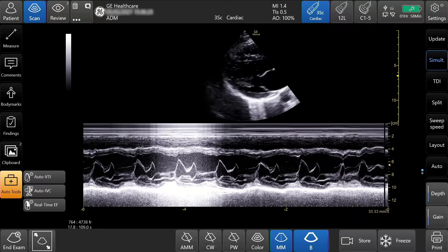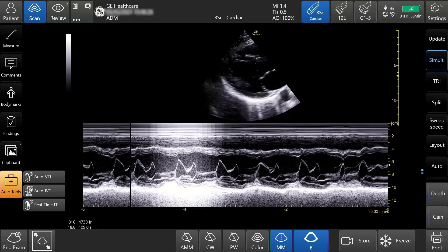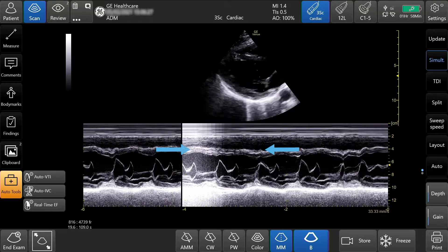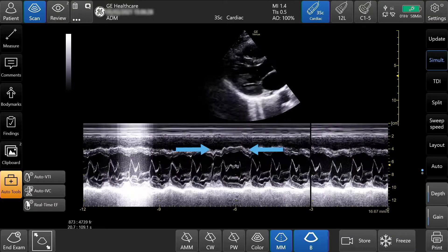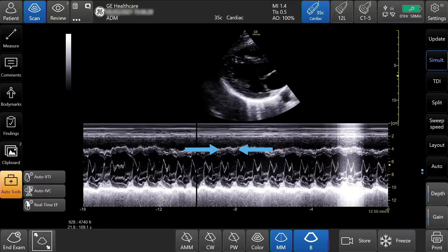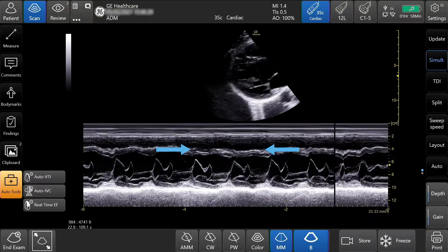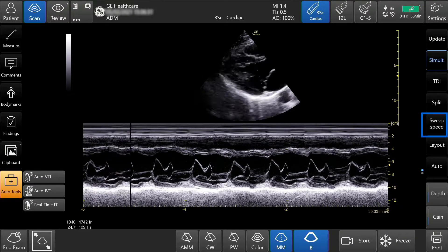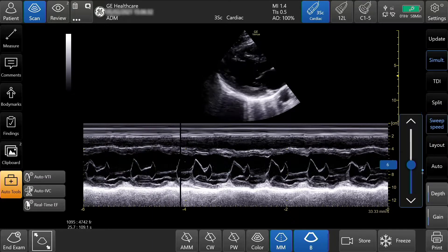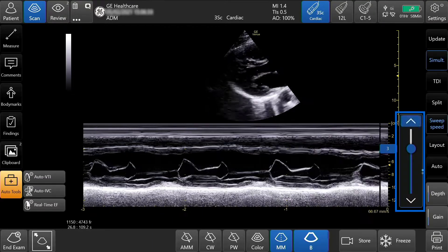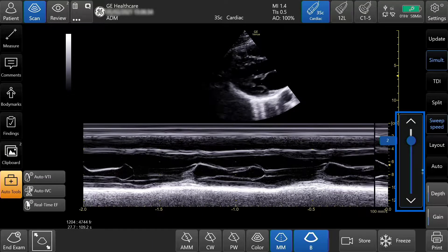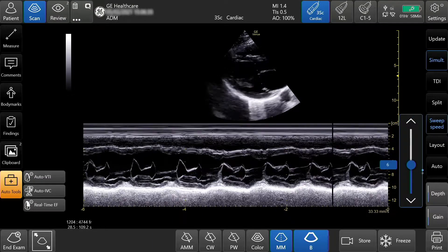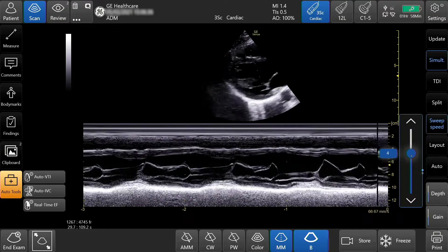To adjust sweep speed, pinch the waveform or tap sweep speed, then tap the arrows or drag the slide bar up or down.